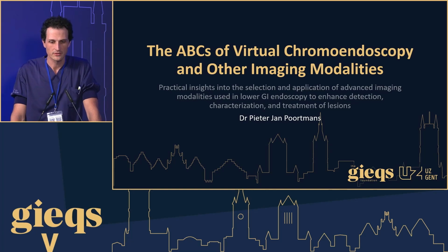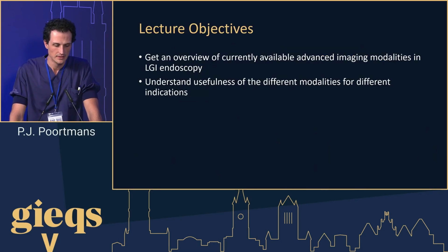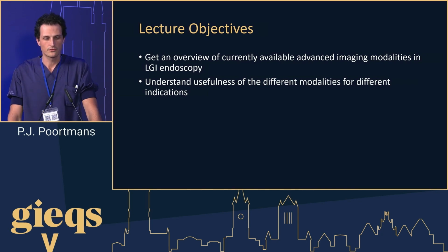I'll be talking about virtual chromo endoscopy and other imaging modalities, for the trainees especially. So the objectives are to get an overview of currently available imaging modalities in lower GI endoscopy, and to understand why it's useful to have different modalities for different indications.